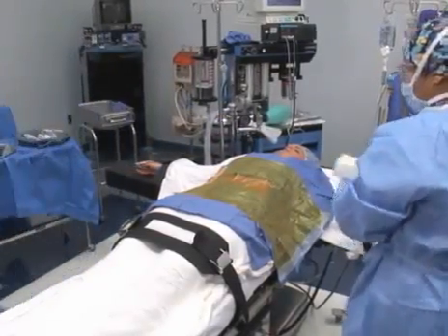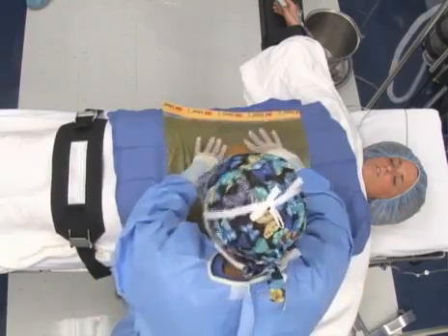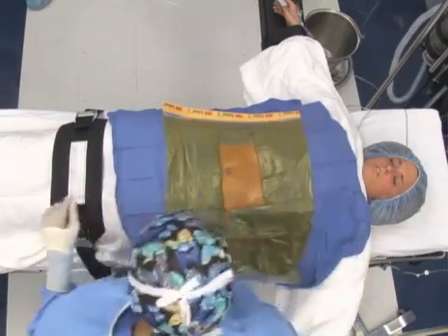During draping, the paper backing is peeled away while the drape is applied. This is done in a way that prevents the drape from tangling and sticking to itself. The surgical technologist and surgeon usually apply the drape together.